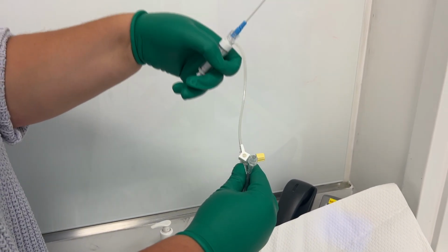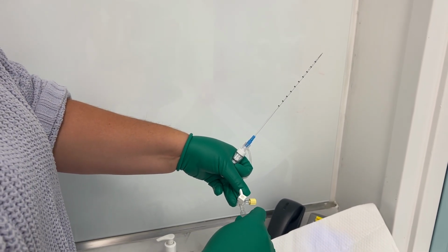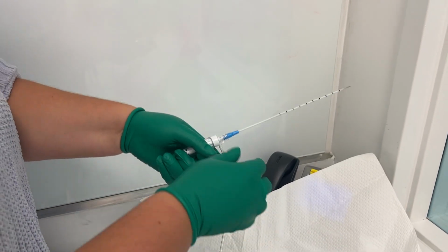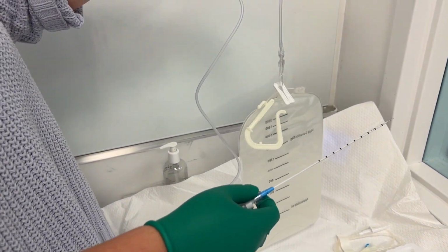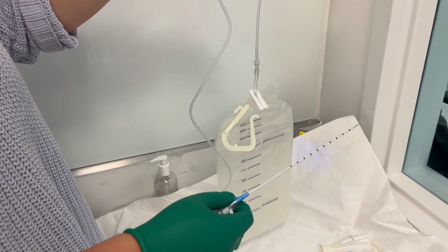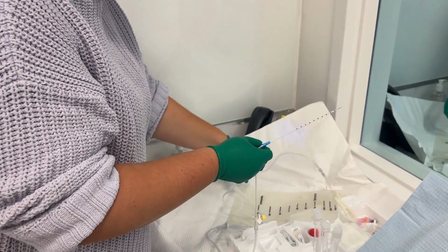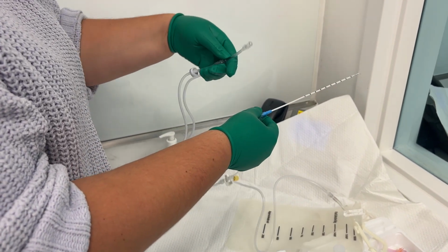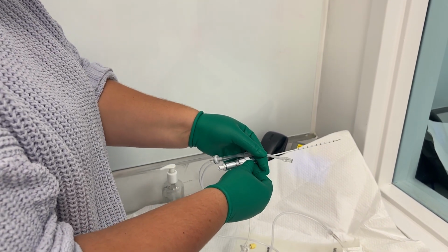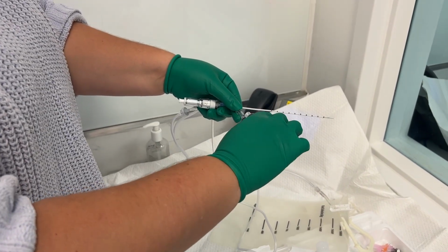You can remember short S, stopcock S. The longer tail will attach to the fluid collection bag, which the fluid will drain into below. And the head of the tubing will attach to a syringe.